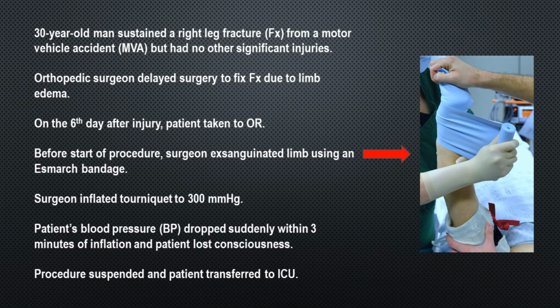The surgeon then inflated the tourniquet to 300. The patient's blood pressure dropped suddenly within 3 minutes of tourniquet inflation, and the patient lost consciousness. The procedure was suspended, and the patient was transferred to the ICU.